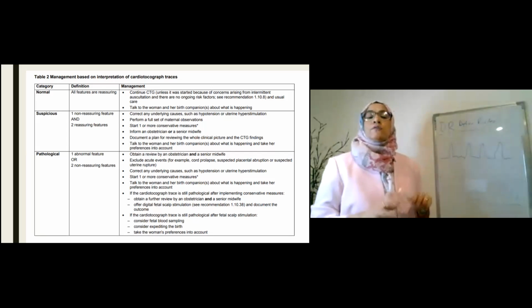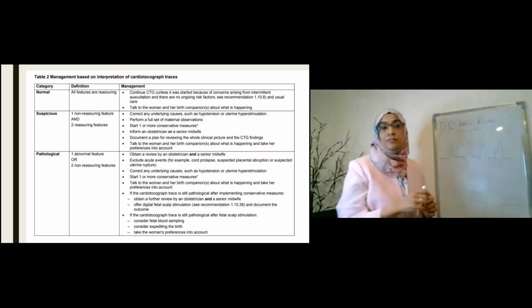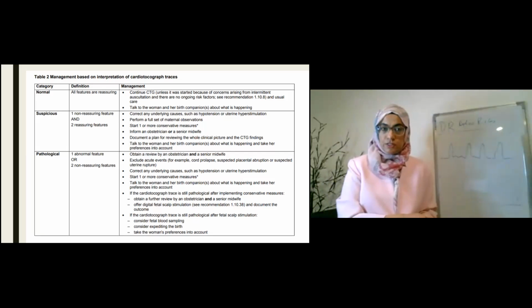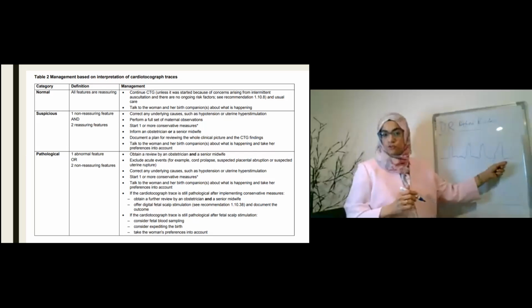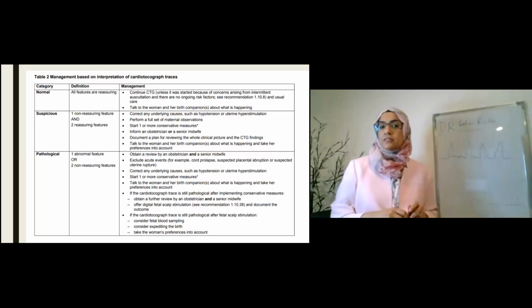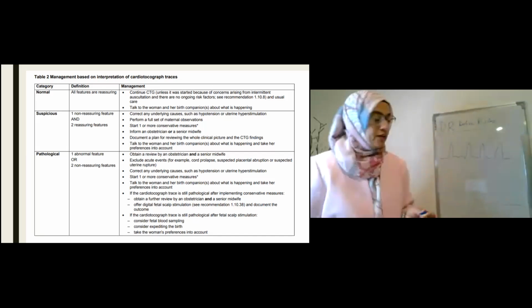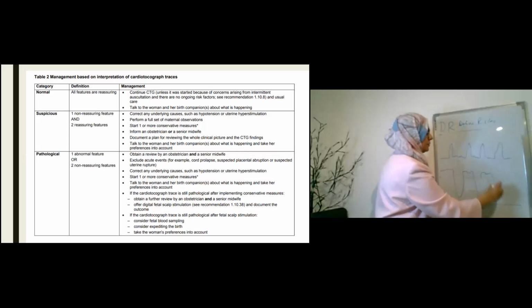Okay, so if that is not the case, and now with our new machines, we are very good in that, and that has reduced over the years that I've been working with the CTG. So if that is not the case, which is really, really rare, and because you asked the question, I answered that. If you have this trace, you have a close to 100% sensitivity or specificity that this baby is fine. Okay. If you have this trace, all right, anybody happy?